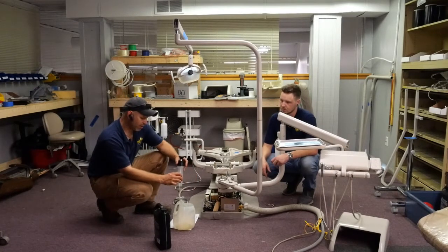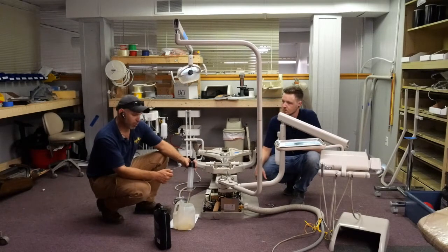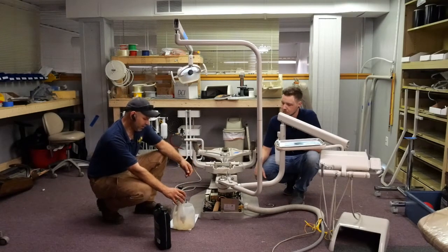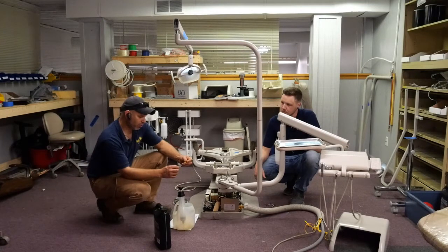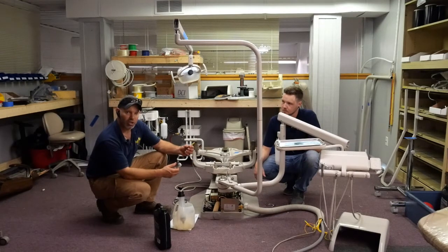So this is a 300 milliliter syringe from an auto parts store. RPI has these as well. The other thing of note is the tool for adjusting the flow control valve is a DCI 3/32 Allen wrench, and you can also just use a standard Allen wrench.